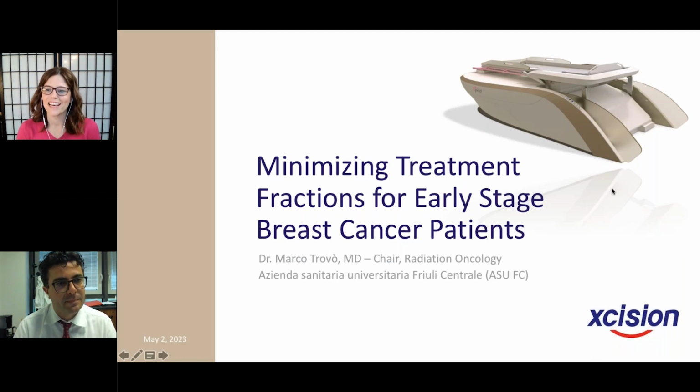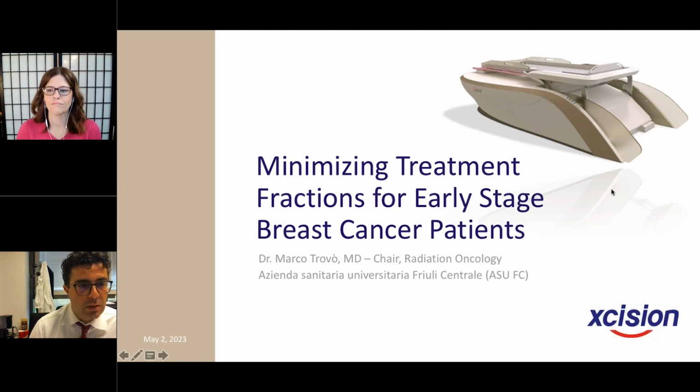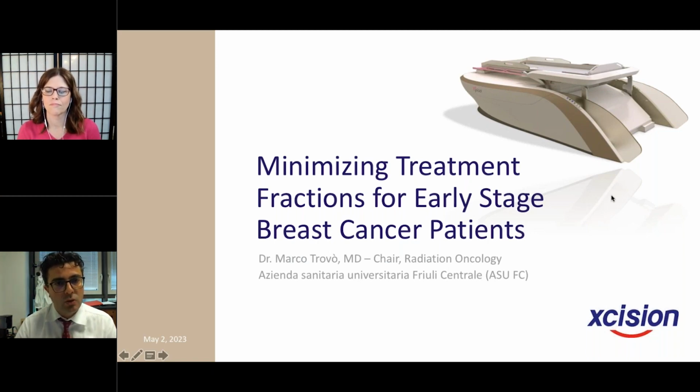So that makes sense. Next question is around some of the results that you're seeing. What results are you seeing regarding toxicity and local control? Okay, so we started treatments a year ago, and we will present in a few days the first results in the first 40 patients treated in a postoperative setting in single fraction, and the results, as I will show you, are excellent. We had no grade 2 toxicity, with a very small and short follow-up, of course, but this allowed us to go on enrolling patients, and in almost a year we treated more than 150 patients without any grade 3 or higher toxicity.